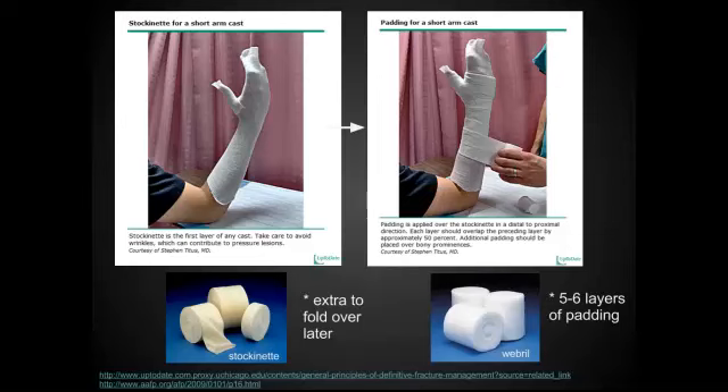Next, you can either wrap or layer the web roll. This is the cushioning of the splint. You should estimate that there are about five to six layers of that padding or web roll that you're placing underneath the fiberglass or plaster.